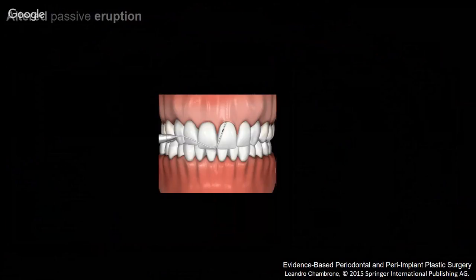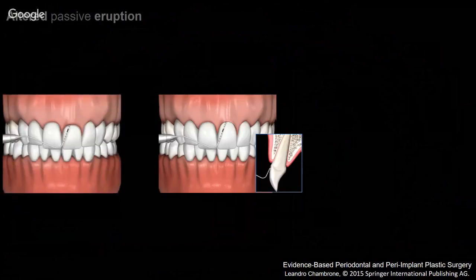But basically, just because we are late as usual, to make everything easy, we can divide it into two groups. So we can see here not a gummy smile at all, healthy periodontium, and healthy gum. In this case, we can see just too much gingiva and too much soft tissue.